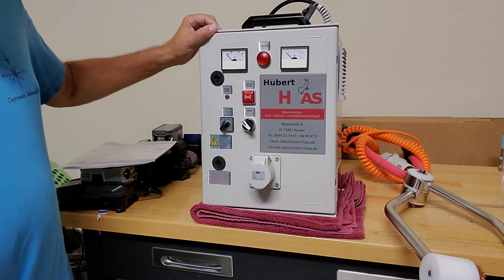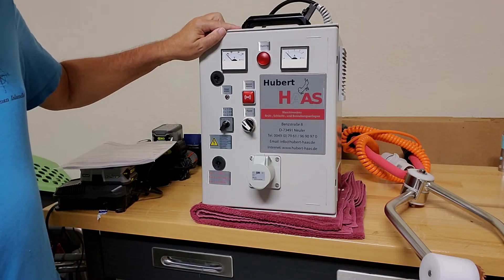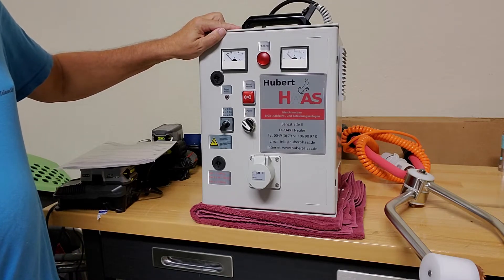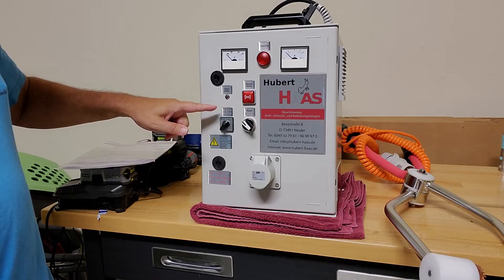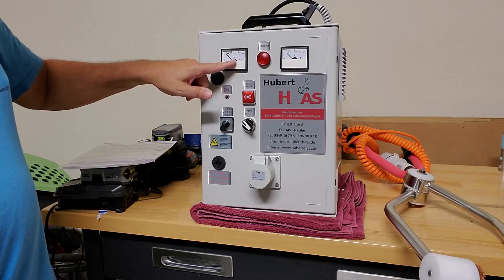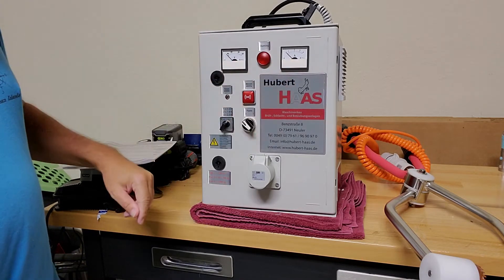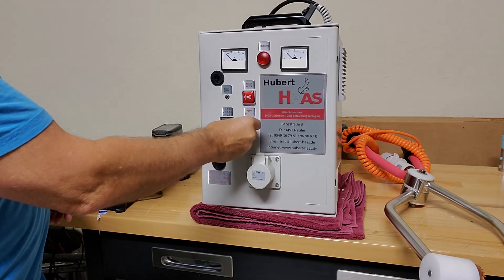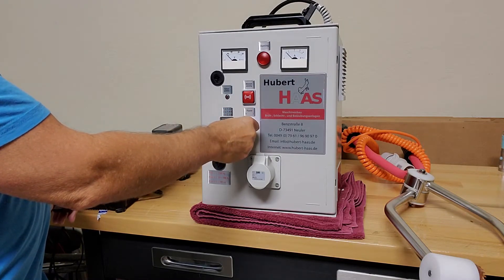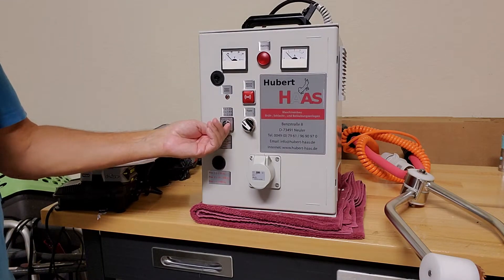This is the TBG 96 from Hubert Haas, made for euthanasia purposes. We're going to go over the different parts of the stunner. Here's the voltmeter, here's the ammeter, here's the on/off switch. I've got it plugged in now, and there's another on/off switch. You get four different program settings on here.